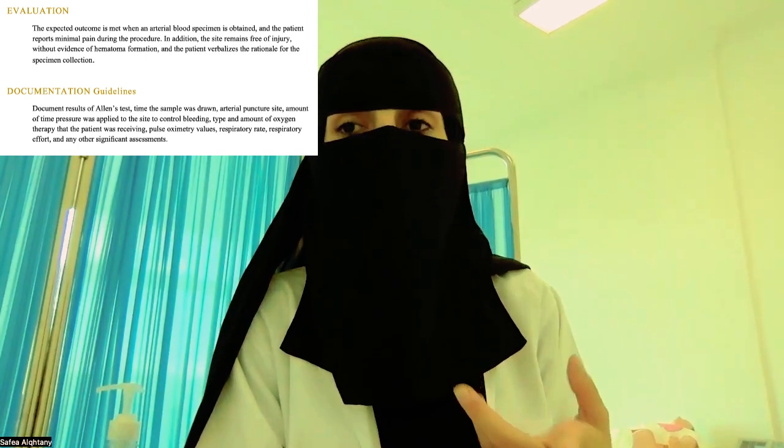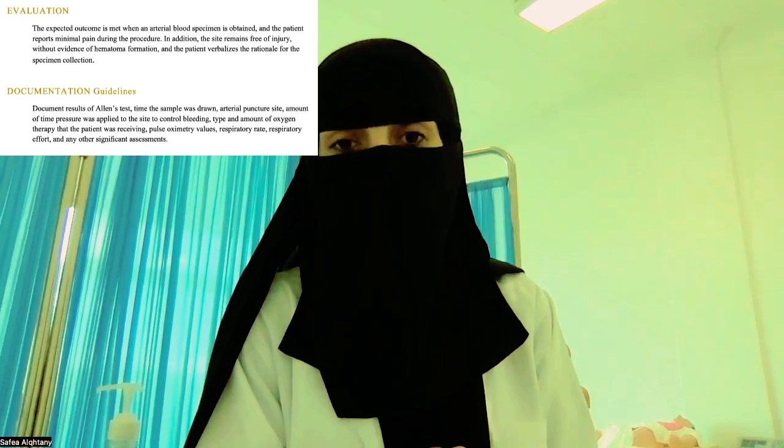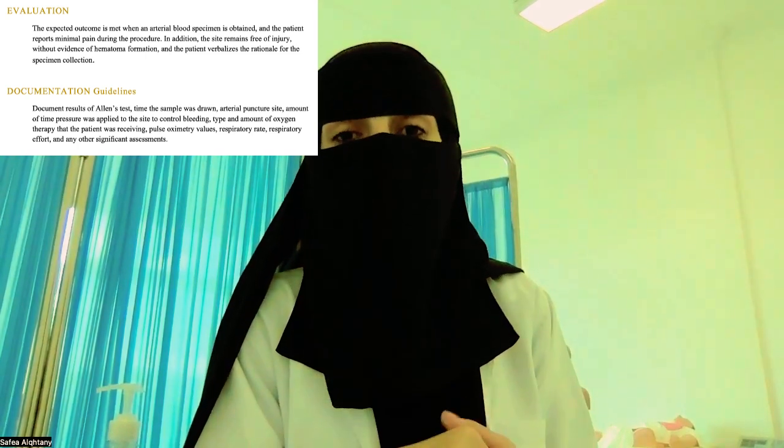Later, we need to document the procedure. What we need to document? We need to document the amount of blood that we withdraw, and we need to document the date, the time, the patient's name, the identification number, the amount of the oxygen that the patient is receiving, and what is the oxygen source. يعني for example لو كان البيشنت على oxygen mask, I need to write that the patient is on oxygen mask and how much he is receiving, for example 2, 5 or 10 liter. I need to document all of this.